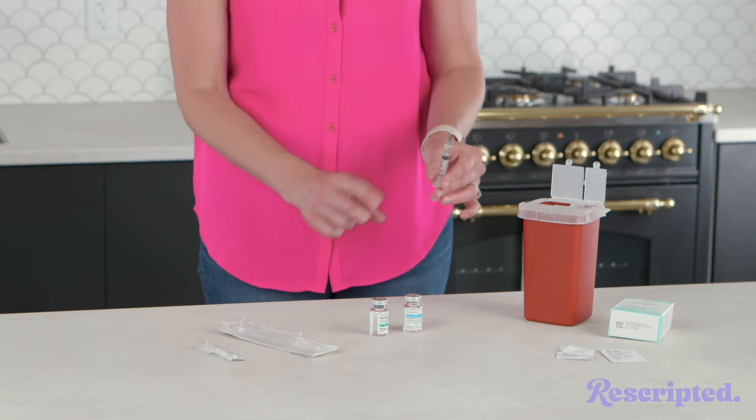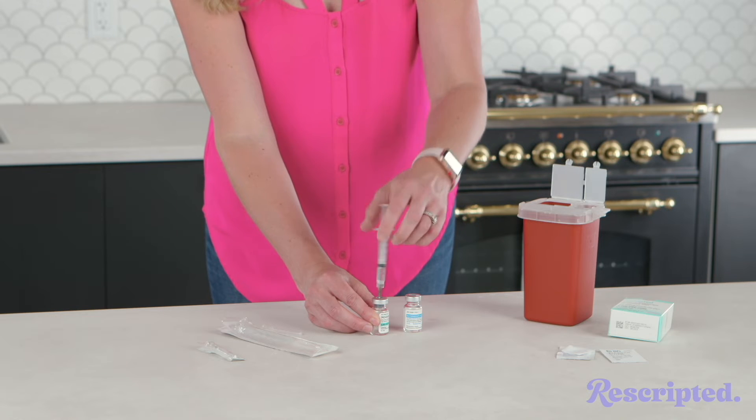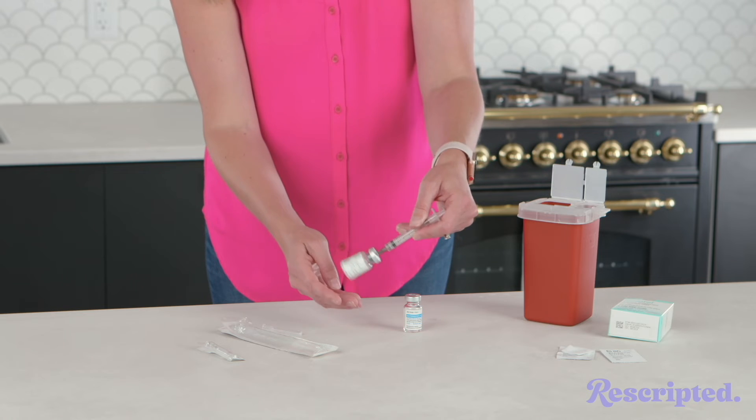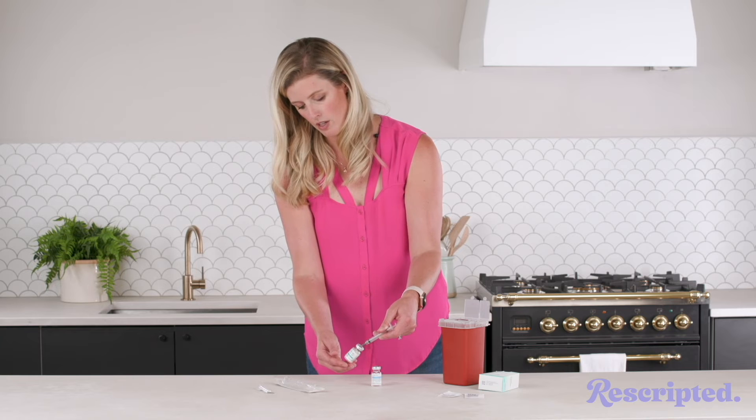Then I'm gonna take that liquid and inject it right into the powder vial. Put all the liquid into the powder, and then you're just gonna swirl it around gently until all of that powder dissolves.